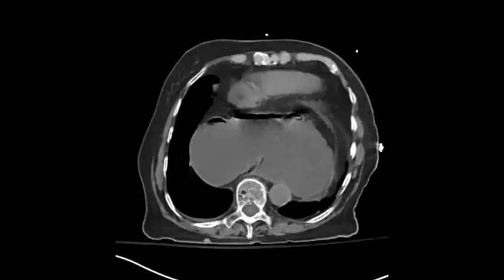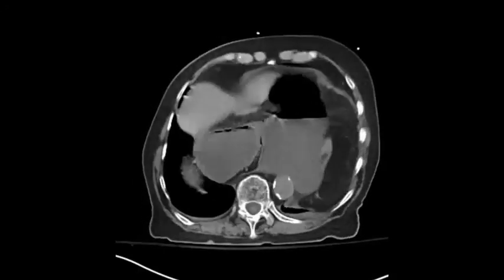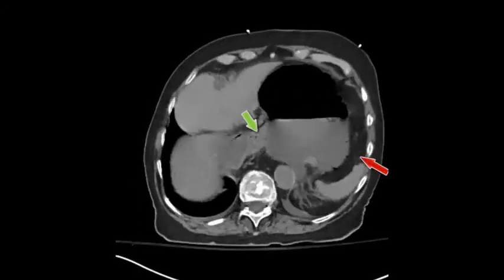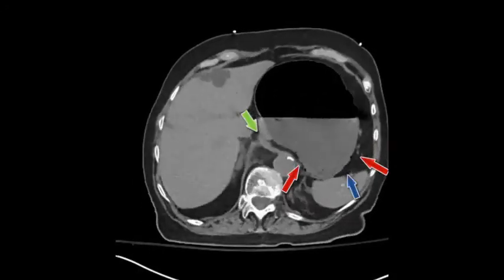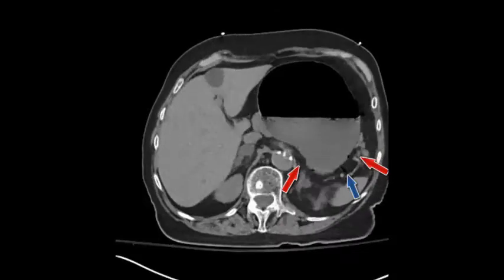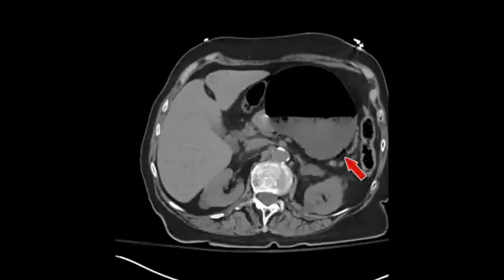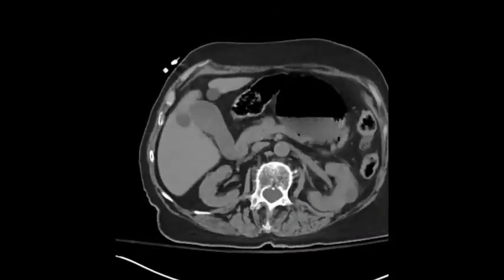Here is the cineclip. We see the distended stomach with an air-fluid level, gastric wall pneumatosis, and air in the draining gastric veins.